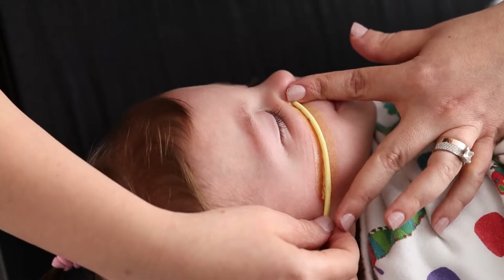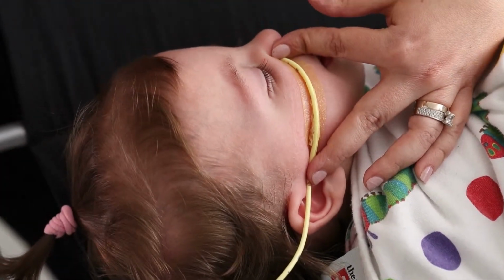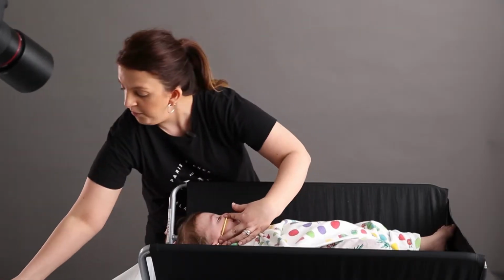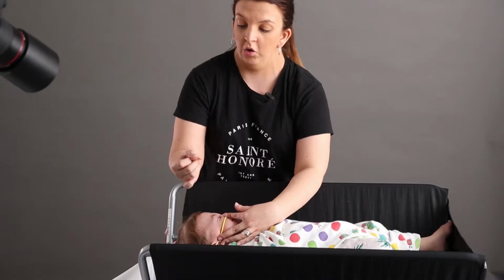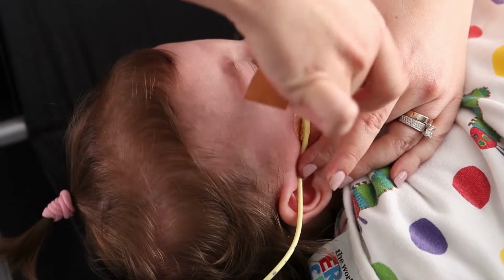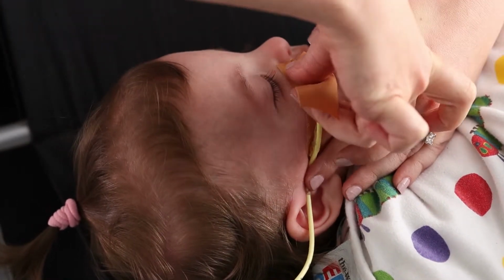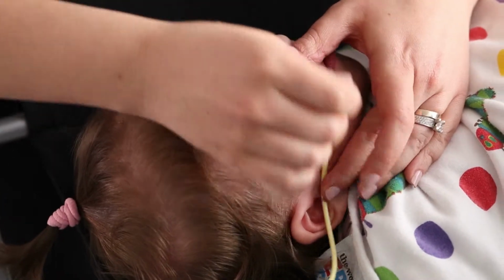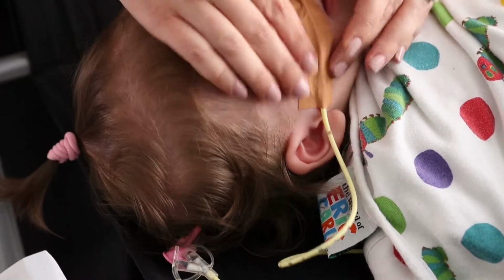I put that across and I hold it from ear to ear. And I've got my pre-cut tape already. Now what I like to do is cut in the middle so it can go in between the actual tube itself. Good girl, Miss Emily. You go all the way to the end. Now I know that's quite secure.